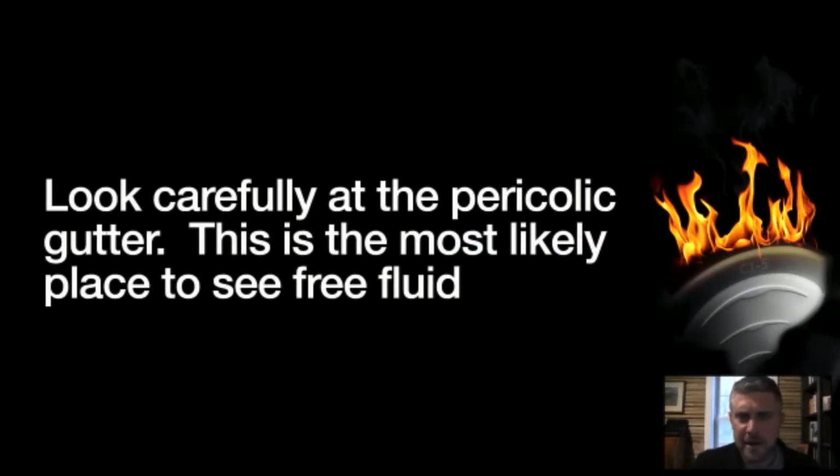Carefully look at the pericolic gutter, right? This is going to be the critical place when you're talking about fluid, because this whole idea of fluid in your belly, it's not a static thing, right? You're injured. The injuries cause problems, and those problems dynamically evolve over time. And so we'd expect to have some dynamic changes to our ultrasound findings as these patients are kind of progressing through their state of injury. So look at the pericolic gutter, right?